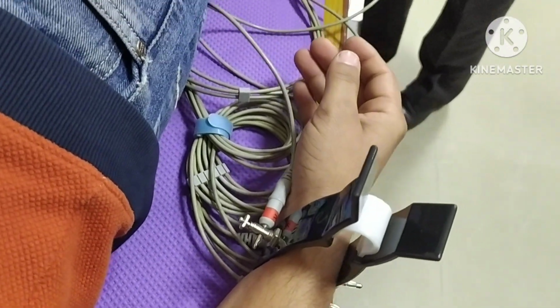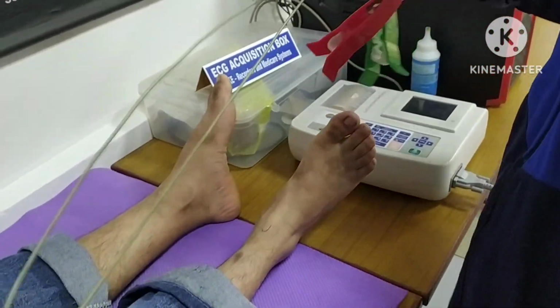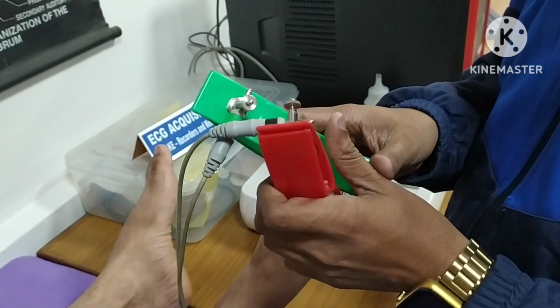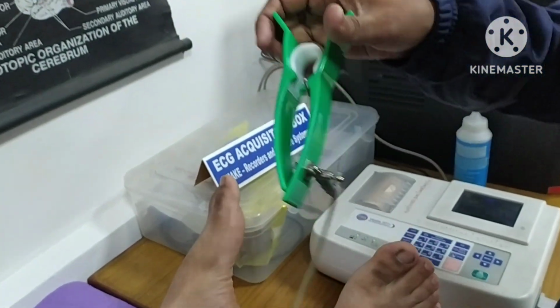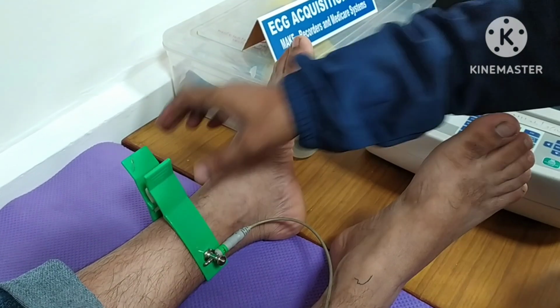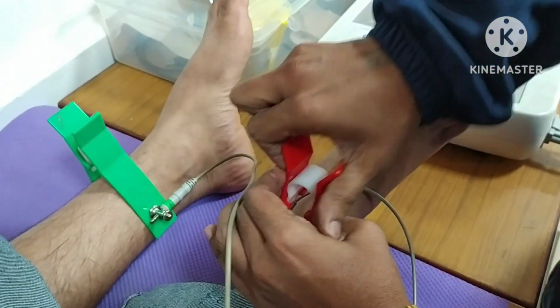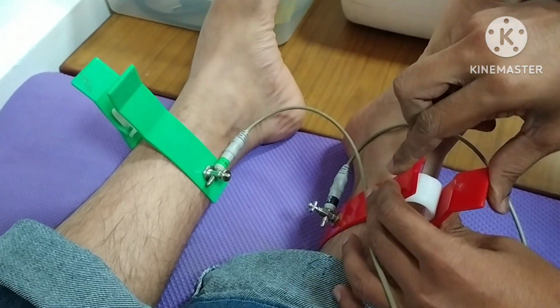Next one is your feet electrodes, RF and F. F is used to connect to the left foot and RF is used to connect to the right foot of the subject.